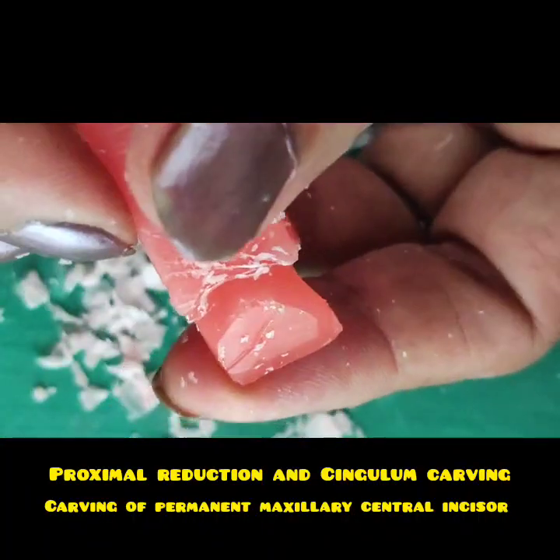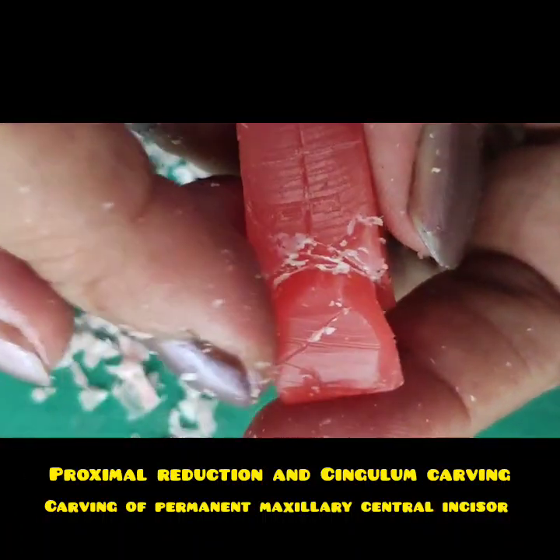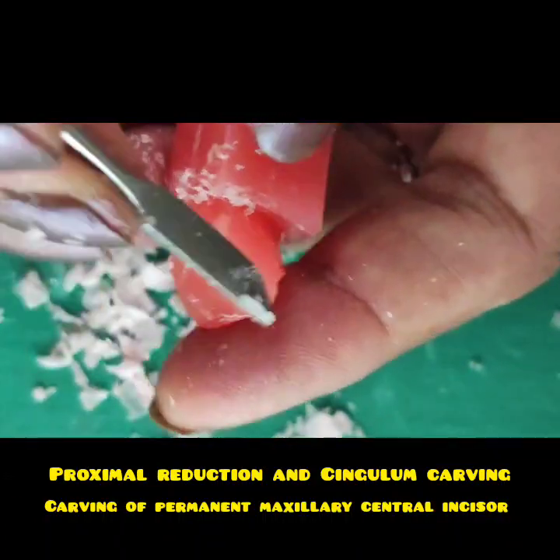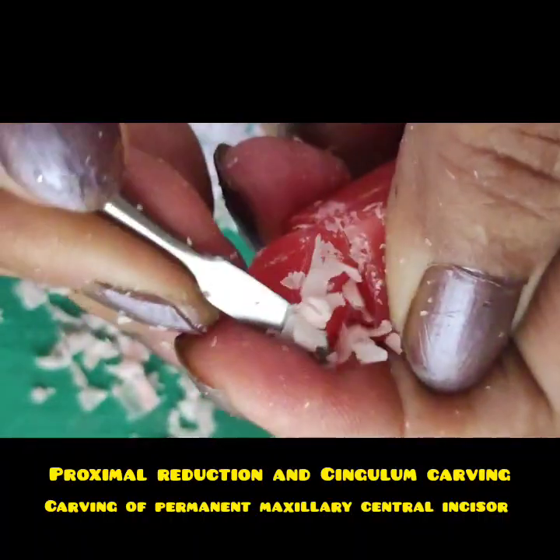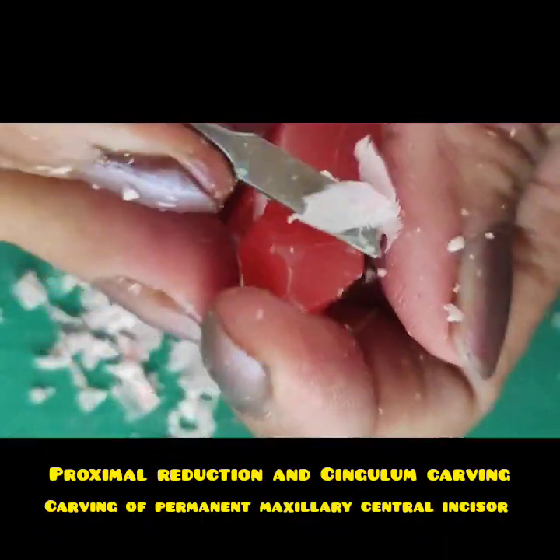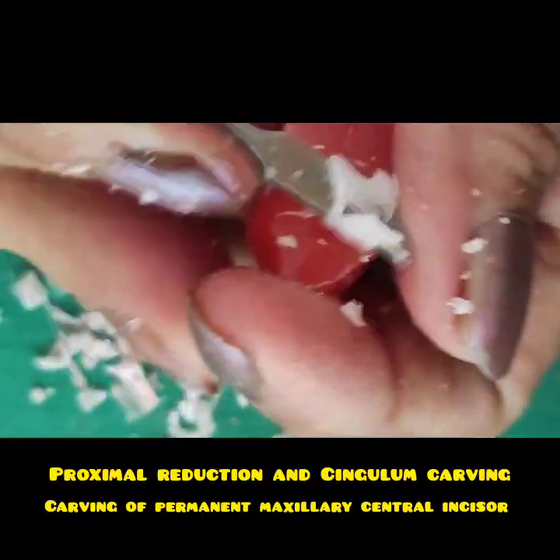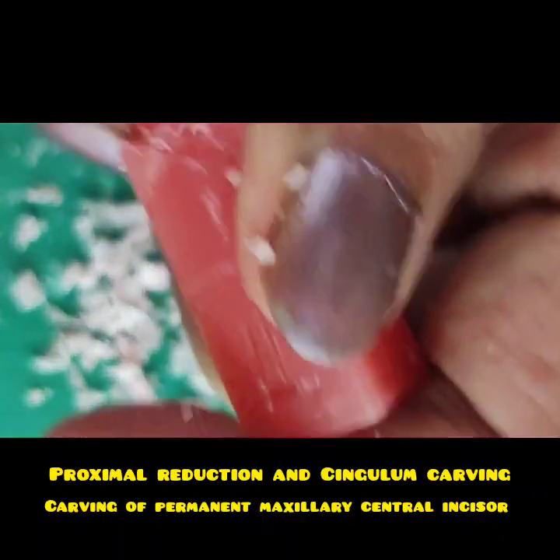Currently the dimensions are a little bigger, so I will reduce a little layer of wax from both sides according to the dimensions, and I will define the U shape.